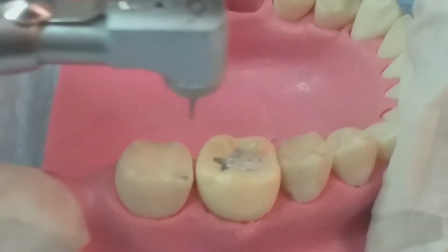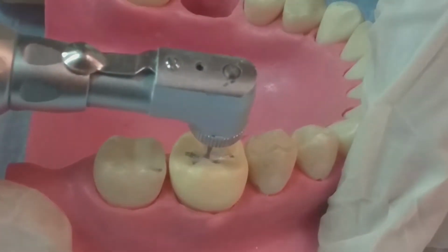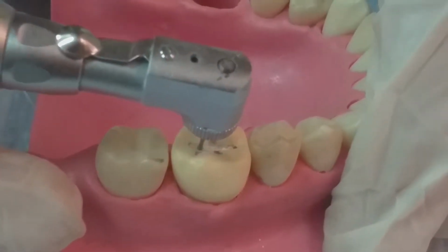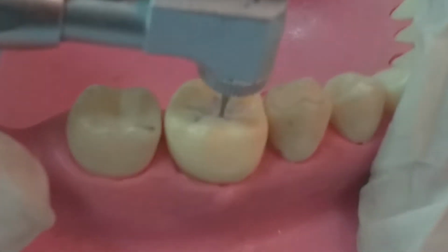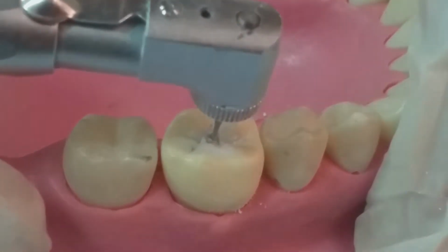This is our inverted bur. We use it for extension of our preparation. We extended the preparation right and left, and go in mesiobuccal and distobuccal groove, and then lingual groove.